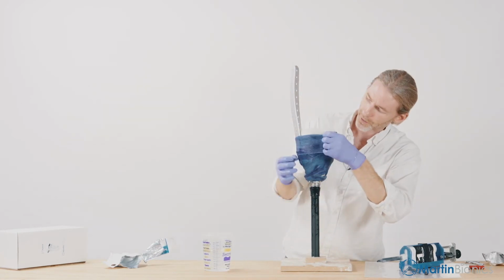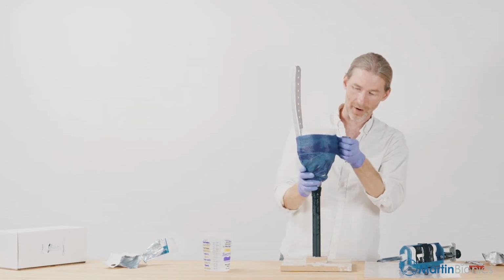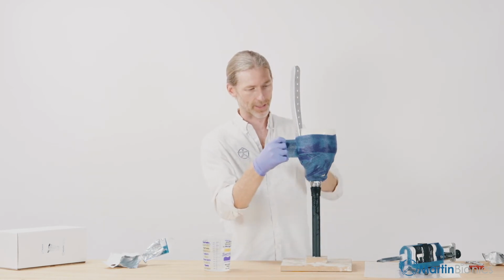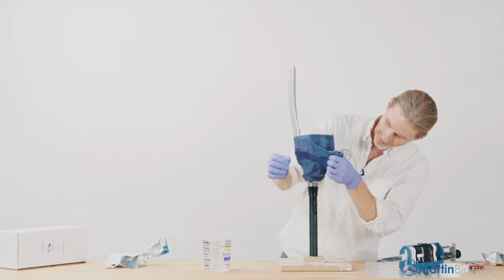I want to make sure the proximal end of our blue outer frame is strong enough, because we're going to be attaching some screws through to connect our lateral struts. Make sure they're nice and secure.